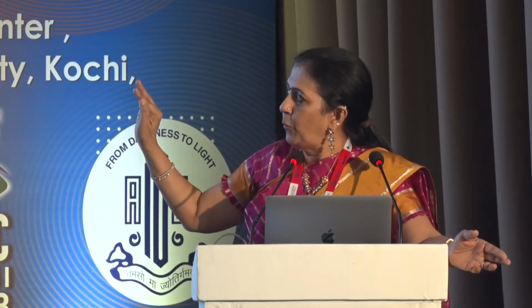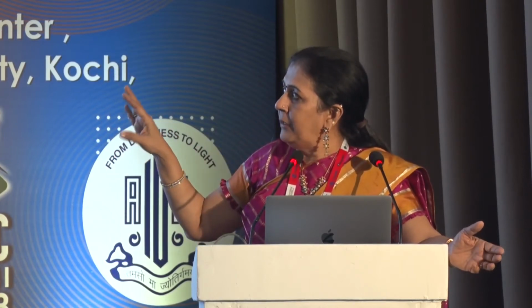So I decide that I'm not going to delay the placement of the CTR now. I position my CTR, push it through with the other instrument into the capsular fornix, keep my phaco probe in the center, ensure that my parameters are low, and keep bringing the fragments forward rather than going deep into the capsular bag. But even then, somehow the posterior capsule looks very floppy, and I'm not too sure. I have brought my parameters down. I decide that I'm going to push my IOL now, because that is going to act as a scaffold in this eye. There is still a lot of cortex and even a small epinucleus, but these could be easily dealt with. I would have to just use tangential force, and then I loosen my capsular hooks and complete the case.